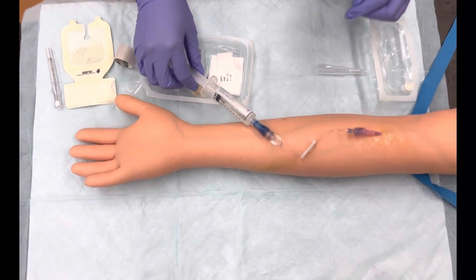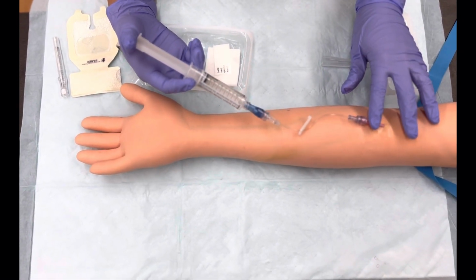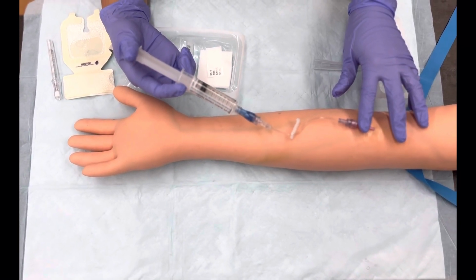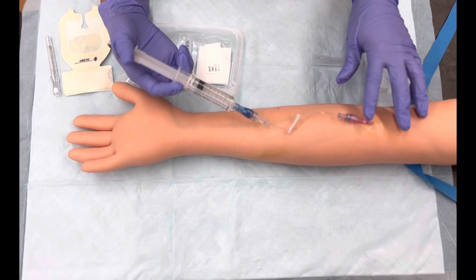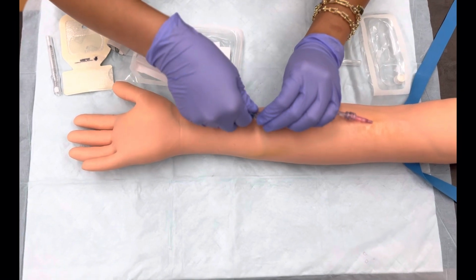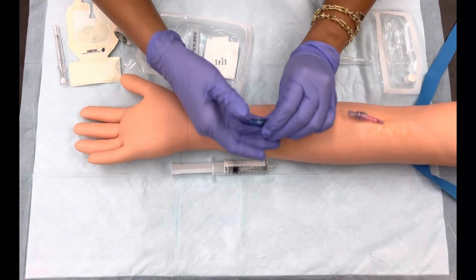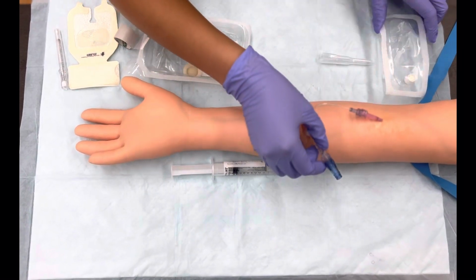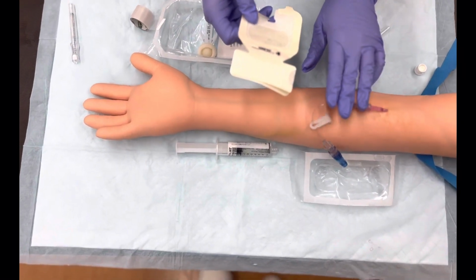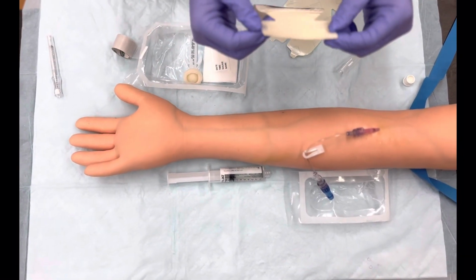Before the next step, you must remove the tourniquet. Then, flush the vein with saline from the attached pre-filled syringe. Once the vein is flushed, remove the syringe. Secure the catheter and then apply the appropriate sterile dressing over the site properly.